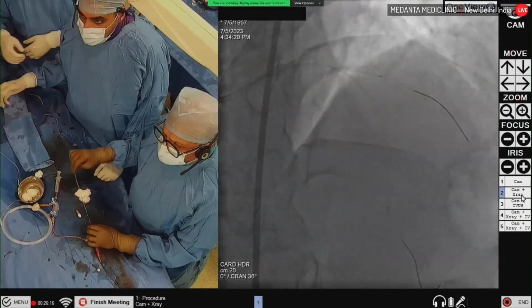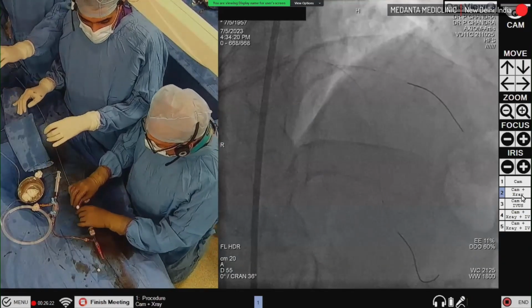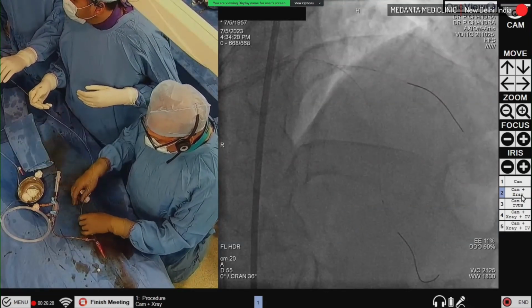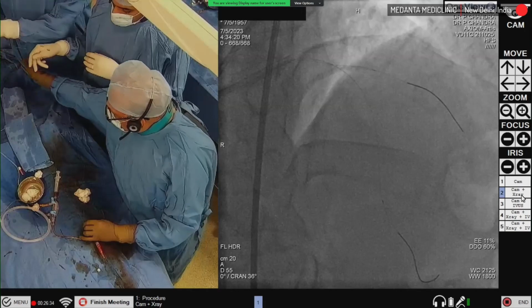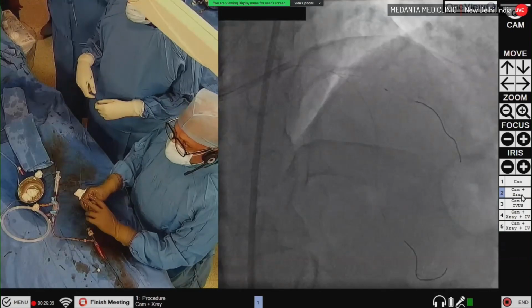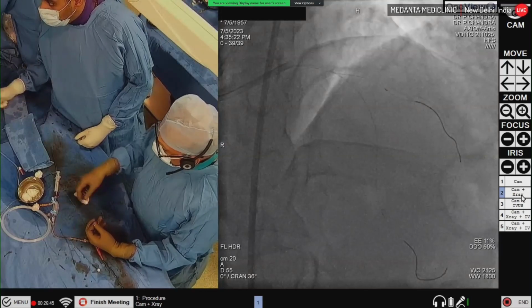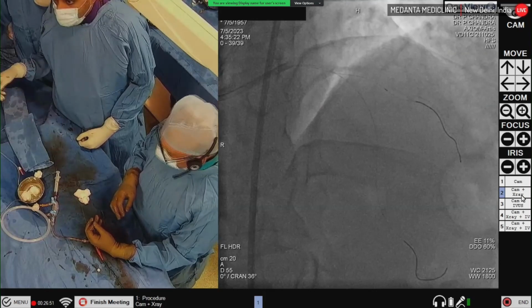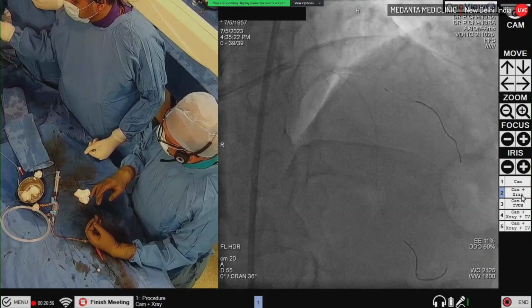Guideliner? No, not Guideliner. First, we'll do the dilatation of this LAD. It will modify the other part. Sometimes we modify the basic plaque in the left LAD, and then we will see how it goes. So keep it on the side. Give me a 3 cutting balloon, 3 millimeter into 15, or 10, whatever you have. Okay, give me. So I'm taking again a cutting balloon.